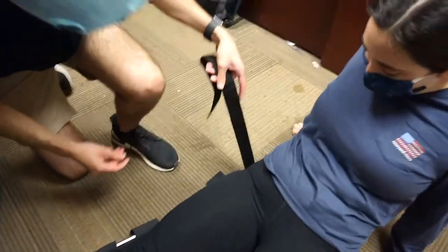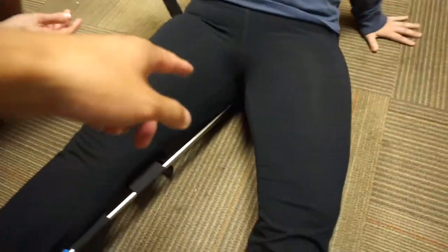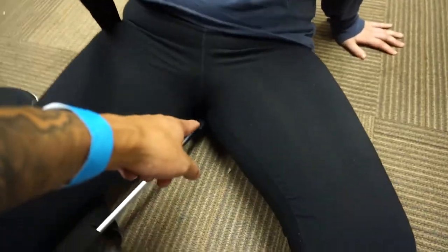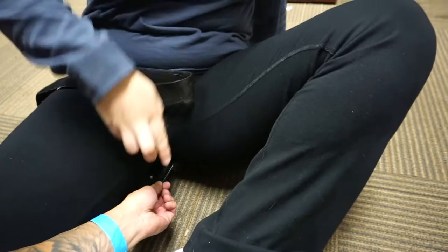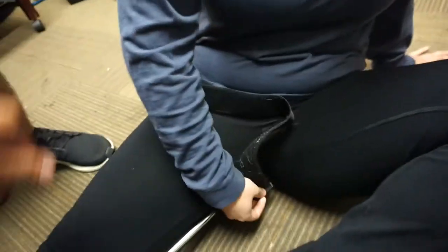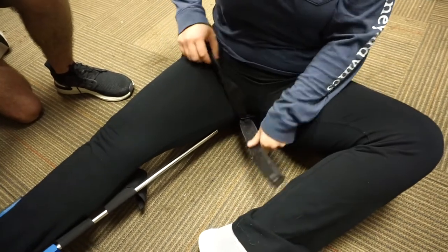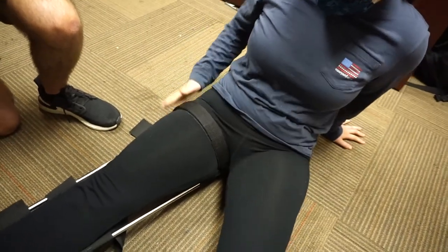The first strap we're going to apply is called the ischial strap. Have Isabella lean to her left side and sit on the hare traction splint. Maybe Isabella can help apply the ischial strap — you're going to feed it through the hook on this side, go over the leg, feed it through this side, come back around, and strap it onto the Velcro. That's the first strap.